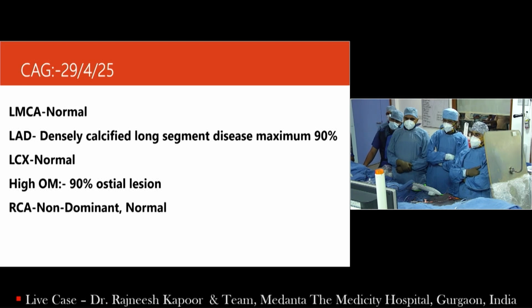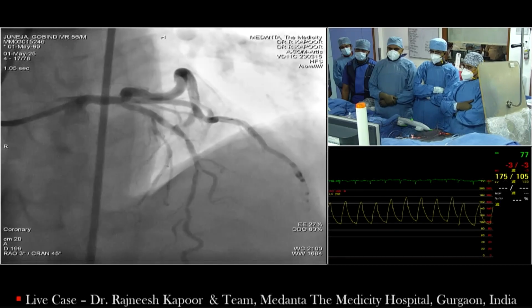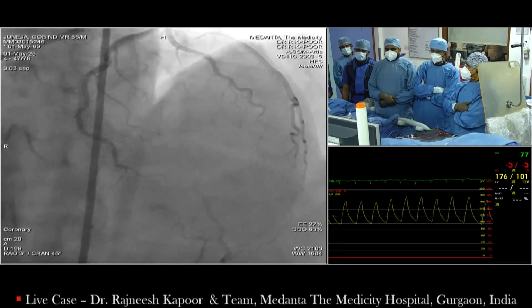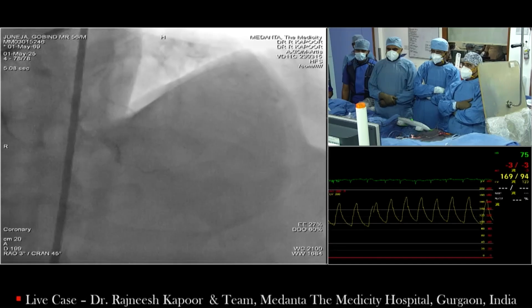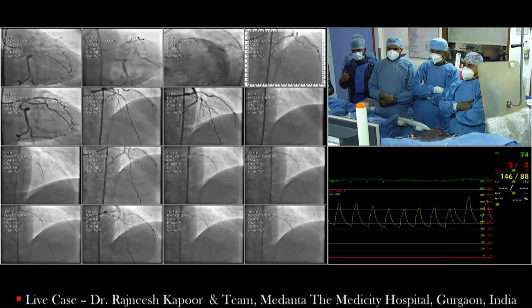Next view. Are they seeing it? We don't see the angio. Can we see the angio? Yeah, please. Is it visible now? Now we have the angio. Okay, please come to the RAO caudal shot, previous shot. Okay.